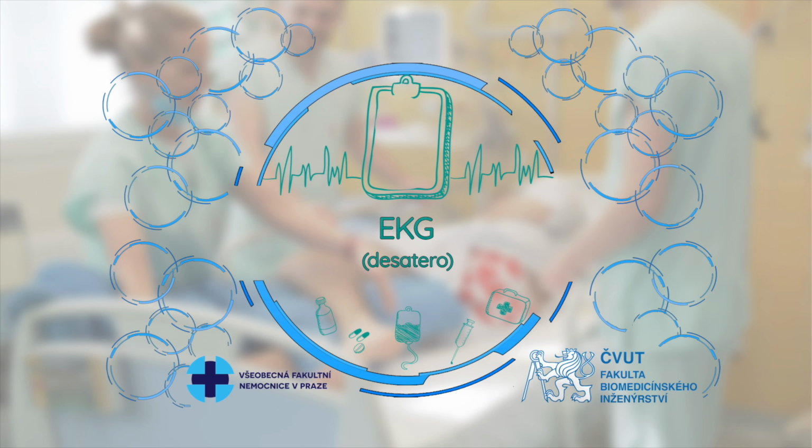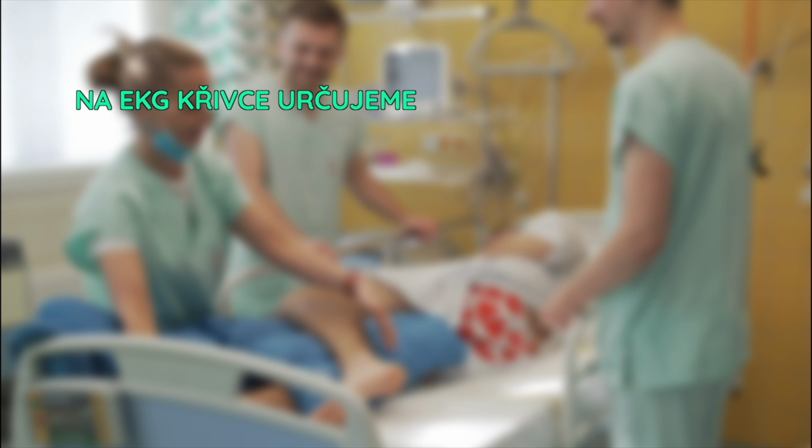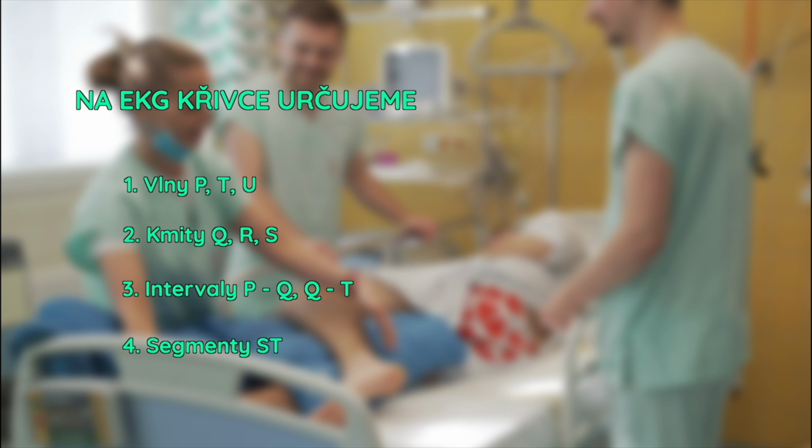Break time. ECG decalogue. On the ECG curve we determine: firstly, the P, T, and U waves. Second, the Q, R, S deflections. Thirdly, the intervals: P, Q interval and Q, T interval. Fourthly, the segments: ST segment.